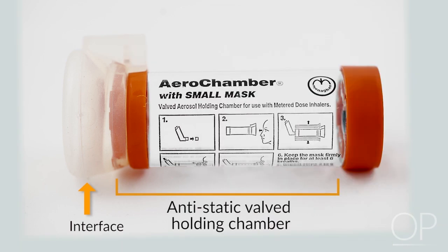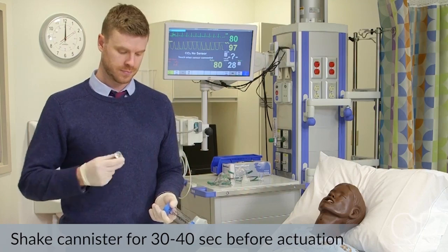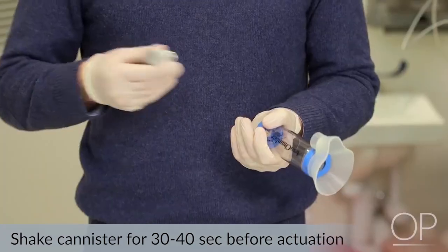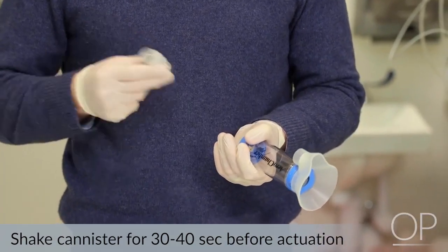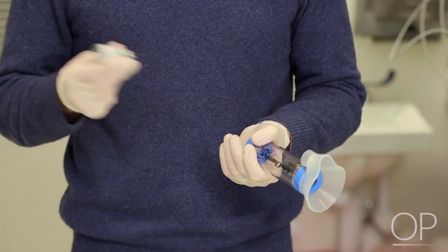The antistatic chamber and the MDI adapter. The MDI adapter is where the chamber interacts with the MDI and is able to accept medication. One important thing to note when using MDIs is to appropriately and vigorously shake the canister before each actuation. About 30 to 40 seconds of aggressive shaking between actuations will ensure that the highest proportion of the prescribed dose on the canister will be administered to your patient.